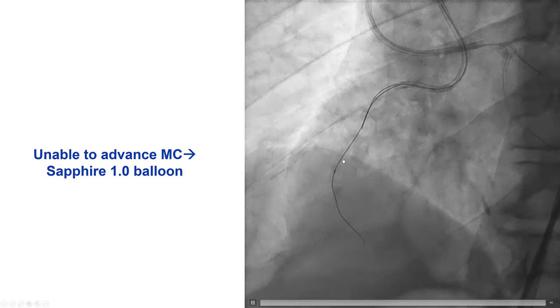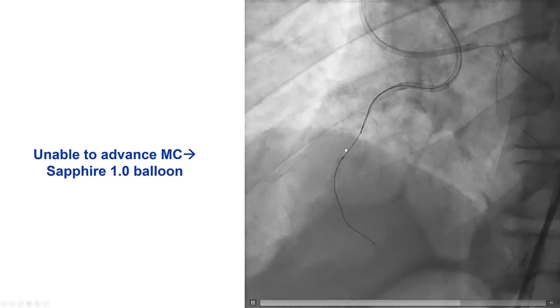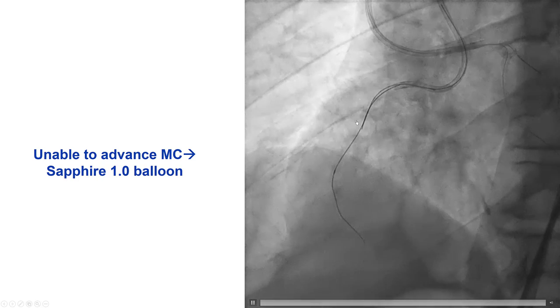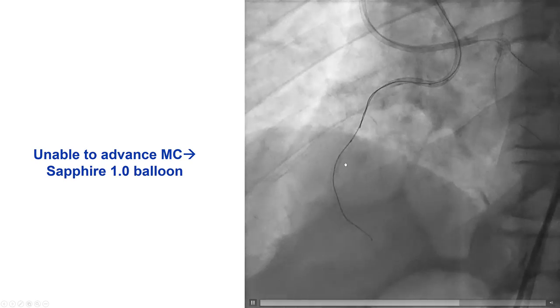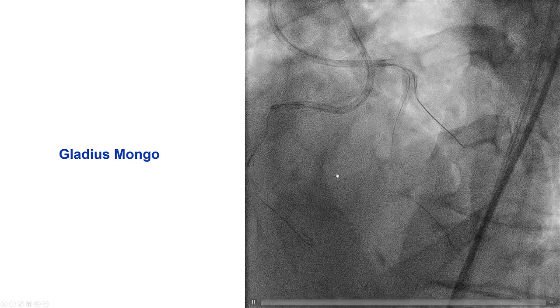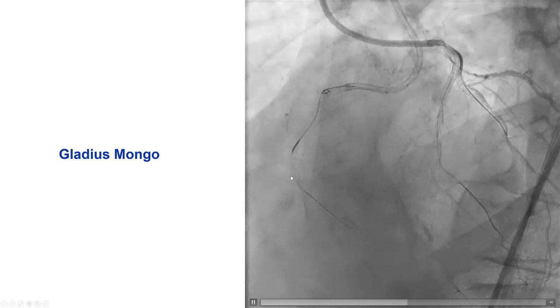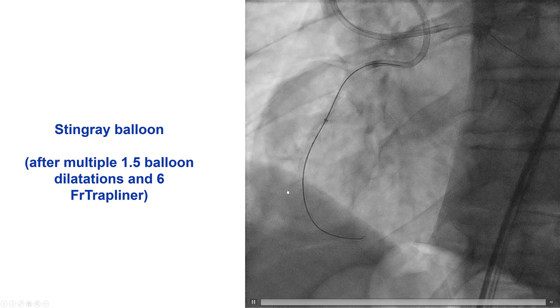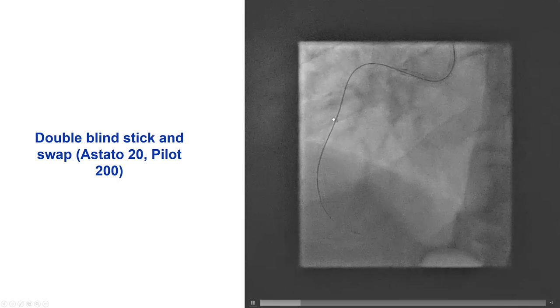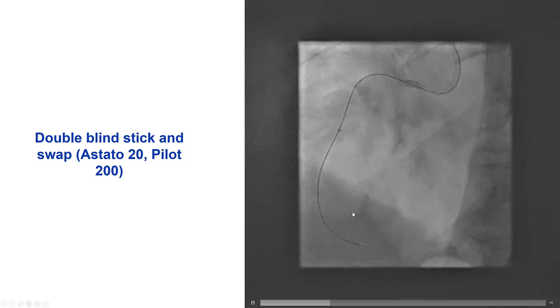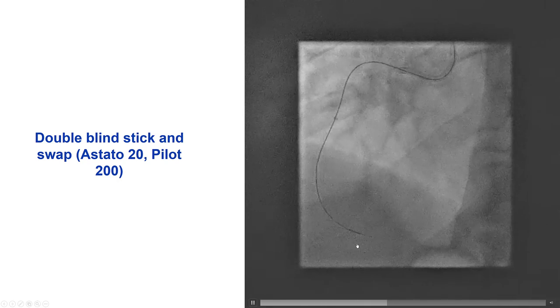The proximal cap was uncrossable and we could not get the microcatheter through. We did balloon inflations with a 1.1 millimeter Sapphire, then switched the Gaia for a Mongo. After multiple additional dilatations with a 1.5 millimeter balloon and using a guide extension, we were finally able to deliver a Stingray balloon all the way to the distal RCA.